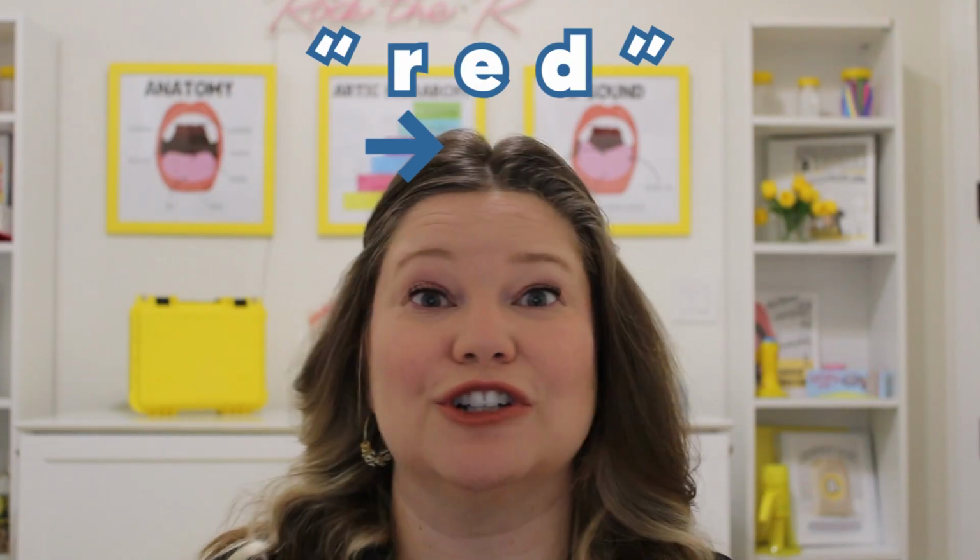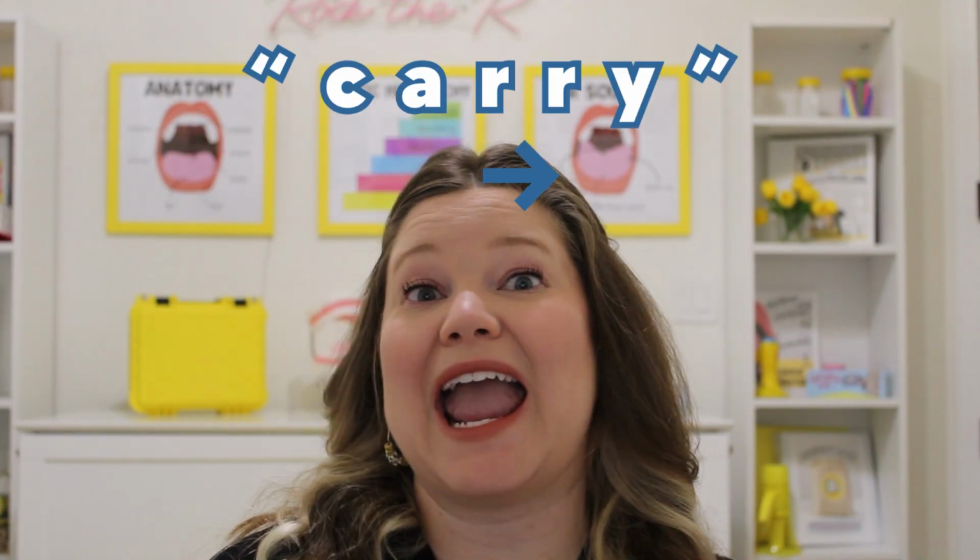When you say a word naturally, the R can blend into the other sounds in the word, making it kind of hard to catch the peaks. So here's the trick. Stretch the R out just a little. Say red or carry to give the wave time to show you what's really going on. Another option is to hit the pause button right when your student is hitting their best R sound so you guys can look at the wave together.